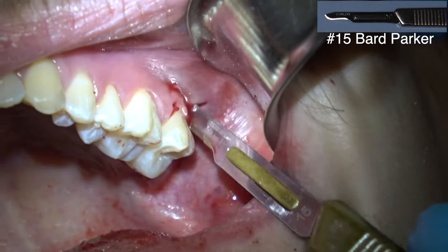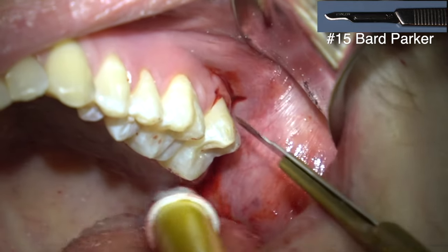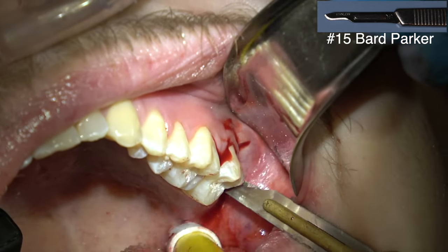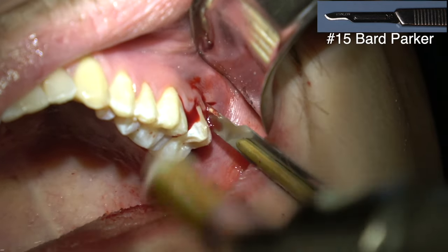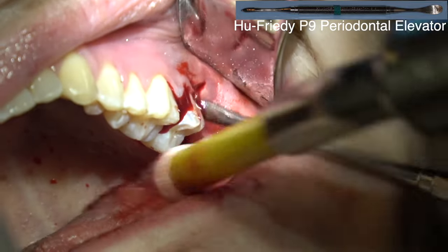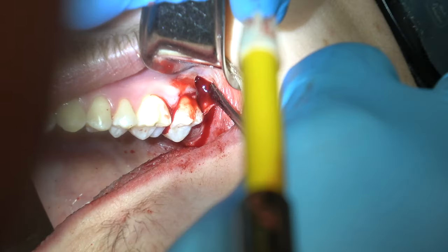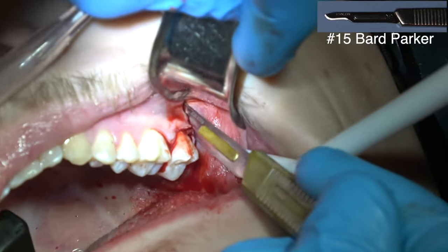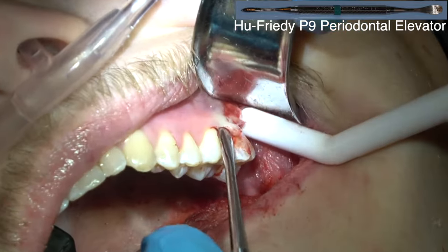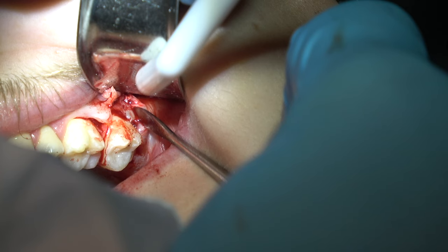This is the upper left one — making a vertical incision, and I've placed an intraligamental local anesthesia. The problem when the roots are completely formed is that to elevate it, you've got to elevate it into the bone behind the tooth, and there's so much root overlap with the second molar that it's hard to get it up and out, especially if it's just plastered against the tooth in front. I'm trying to get this elevator between the third molar and the second molar and it's just so tight I can't get it in there.